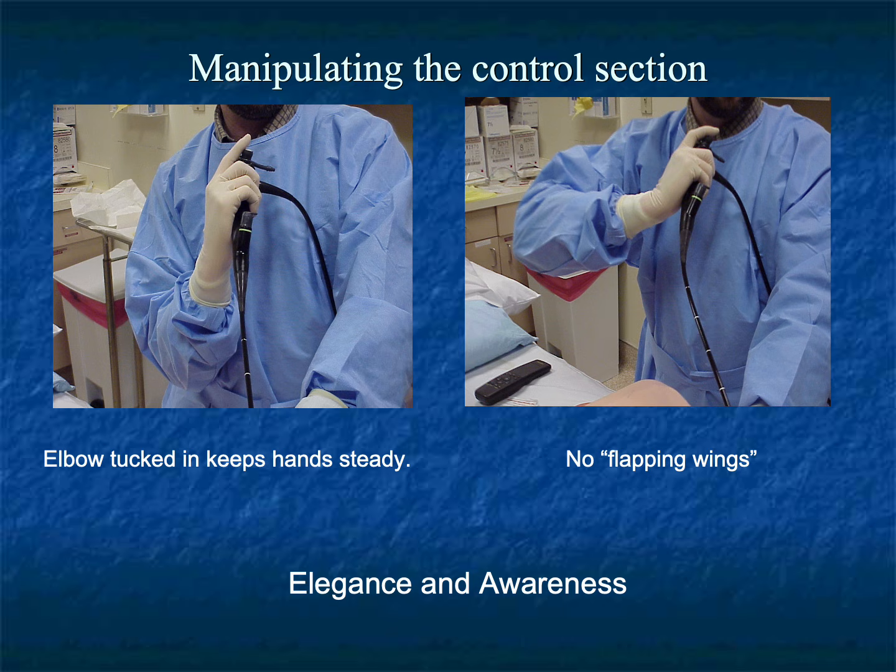The insertion tube should be stabilized, not twisted. The scope should remain aligned. The body should remain balanced. These principles may initially seem minor, yet procedural maturity emerges through the accumulation of small, disciplined habits.